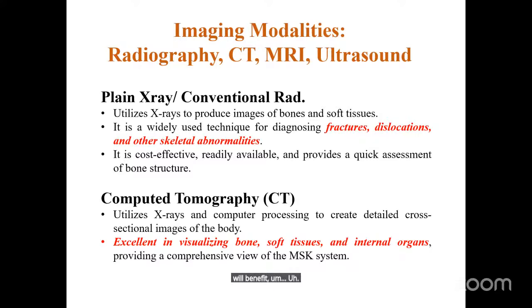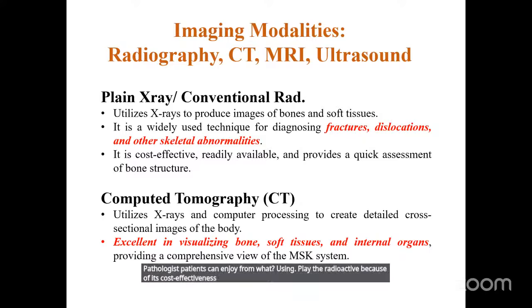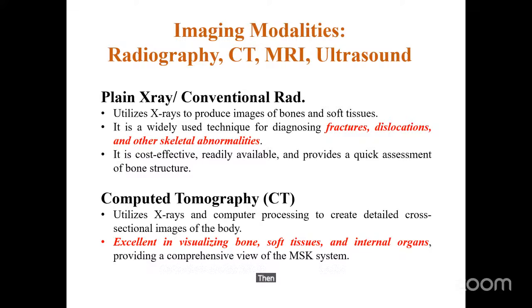So basically, most skeletal conditions and some associated soft tissue pathologies can be assessed using radiography because of its cost effectiveness and ready availability. Then we come to CT.